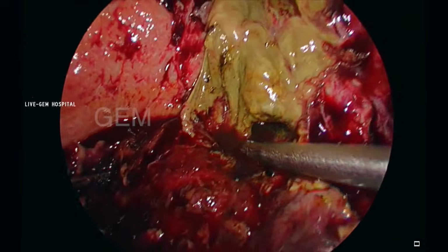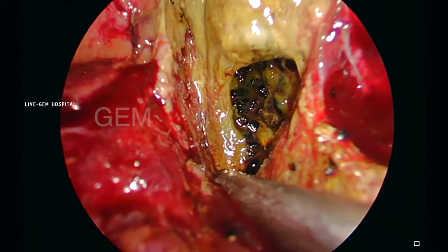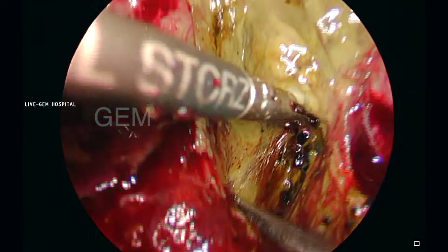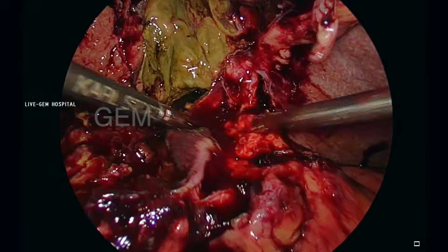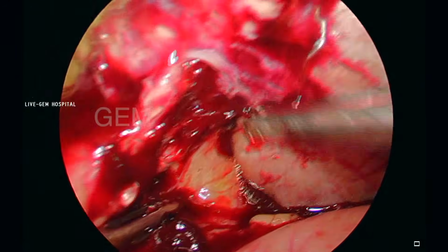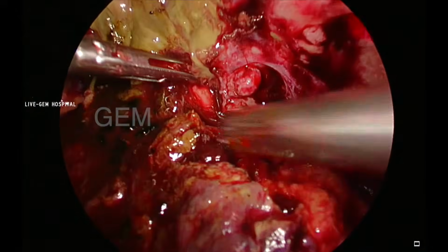And if you leave any stone, it will produce a postoperative abscess in that area. So I have to remove the entire stone. That is the first important work. If there are multiple stones, remove the stones first, then go for the gallbladder dissection. Our mind says, okay, we'll take out the stone later, but it is very difficult.